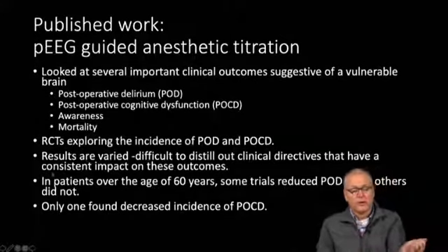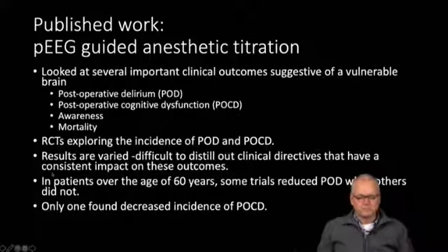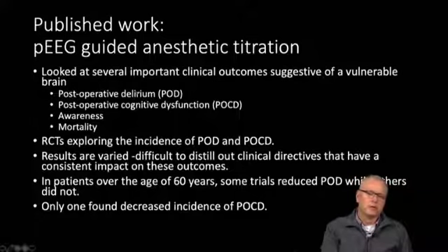Let's go over some of the published work in this space. Using processed EEG guided anesthetic titration, looking at some clinical outcomes of interest. And I've listed them here. Postoperative delirium, postoperative cognitive dysfunction, awareness, mortality.